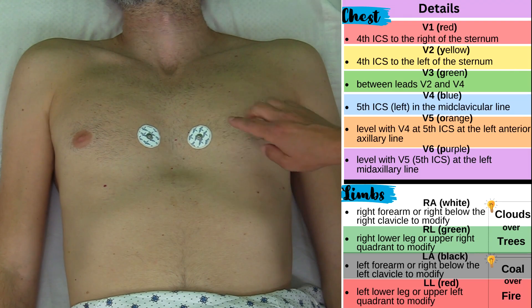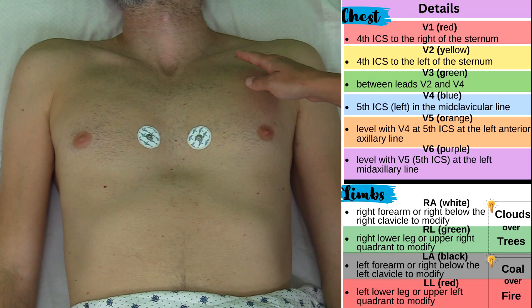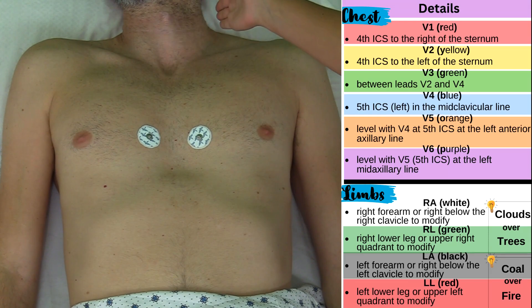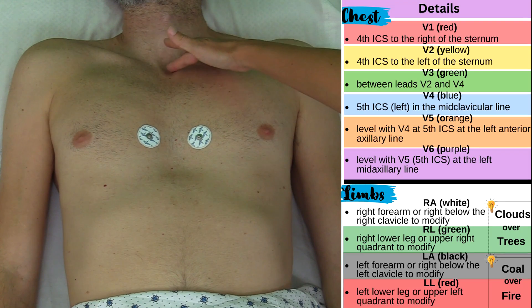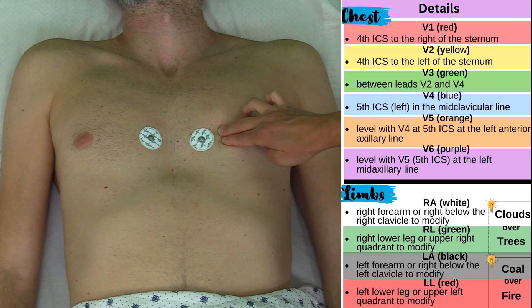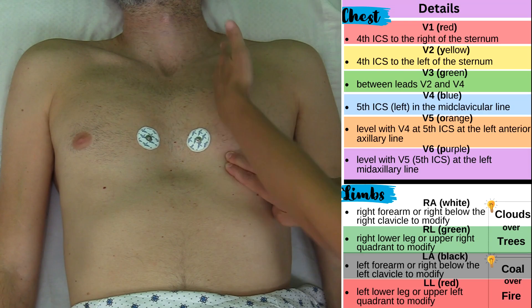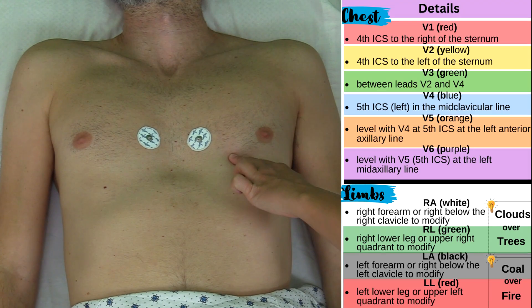Now I'm going to place V4 — I'm temporarily skipping V3 because V3 is going to go between V2 and V4. V4 is going to be at the fifth intercostal space along the mid-clavicular line. Find your clavicle, the beginning and end of it, and cut it down the middle — so about this area. Repeating the same steps: second rib, second intercostal space, third intercostal space, fourth intercostal space, fifth intercostal space — and mid-clavicular line. So about right here is where we're going to place V4.